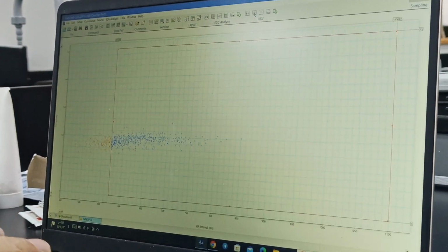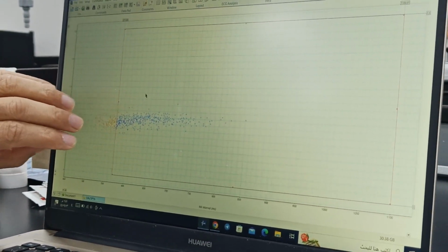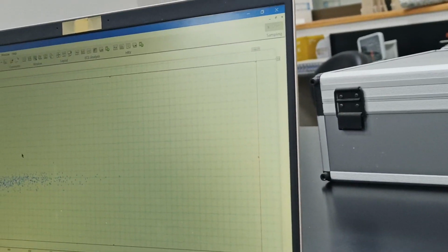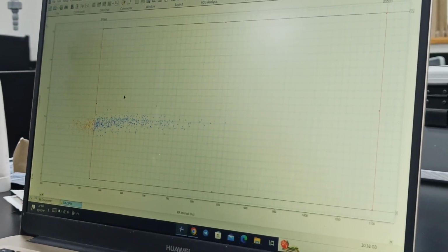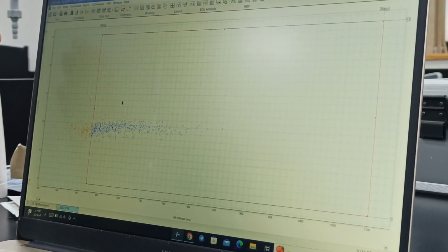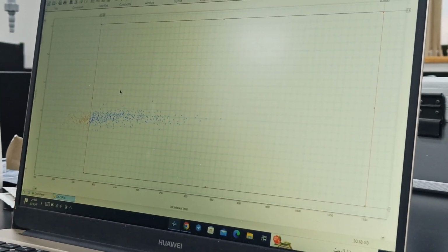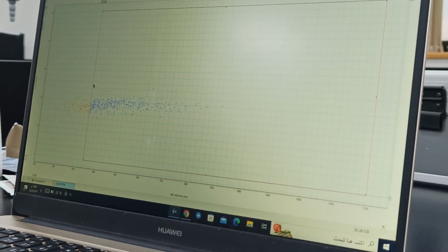Again, there are a lot of things which are. So can you tell me why now it is segregated there towards shorter RR intervals? Because the program is unsure if they should be included. No, we can include that, but why is the shift here? Maybe the parasympathetic is not dominating here. Yes, of course. Simple thing. During the tilt, parasympathetic is less and sympathetic is more. So the heart rate is faster. So the RR interval is shorter. So this is not abnormal. This is all normal. We will just include this.